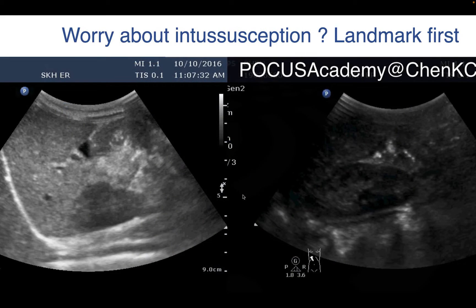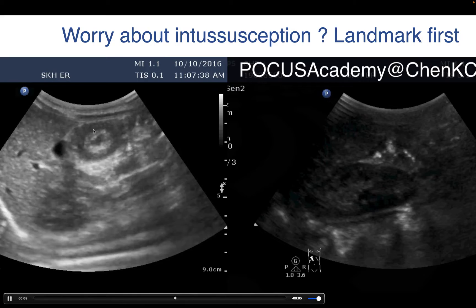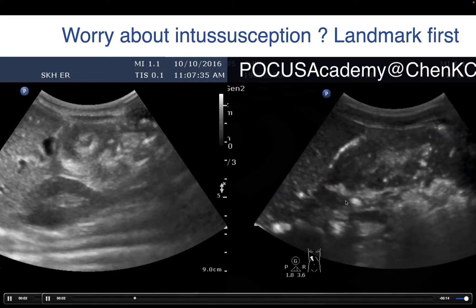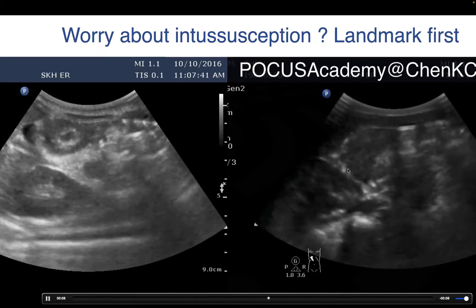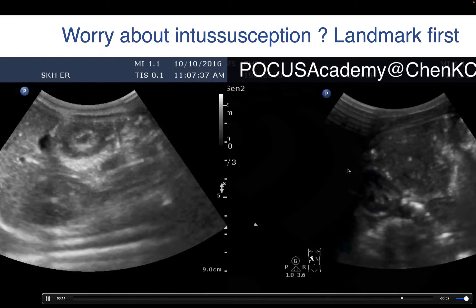When you are worried about patients having intussusception, again scan the landmark first. What is the landmark for intussusception, especially in pediatric patients? The most common type of intussusception in pediatric patients is the ileocolic type. So we put our transducer on the right upper abdomen. We can see these landmarks — liver, kidney. We look at these regions. In one case, we see the target sign. In another case, we see a pseudo-kidney sign. For adults, you should scan systematically rather than just these regions, because for adults, it's a different story.